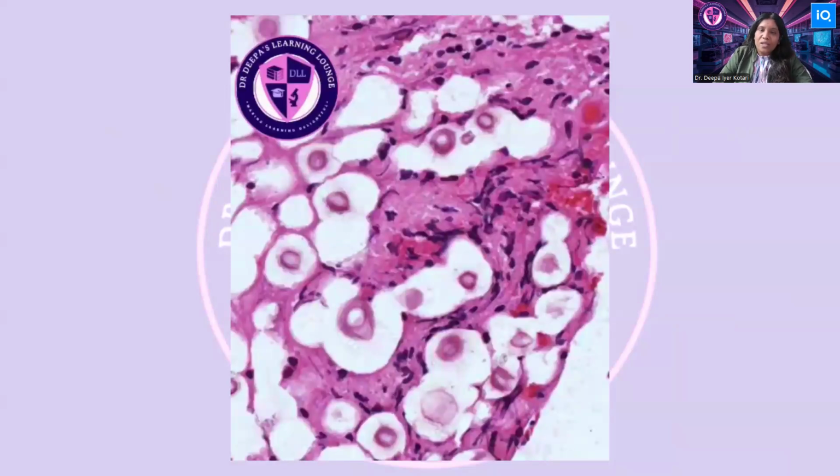The most characteristic feature of Cryptococcus is its mucopolysaccharide capsule, which is thick and prominent. This creates a clear halo around the organisms in an H&E slide. If you notice, these organisms have a narrow-based budding and not broad-based.